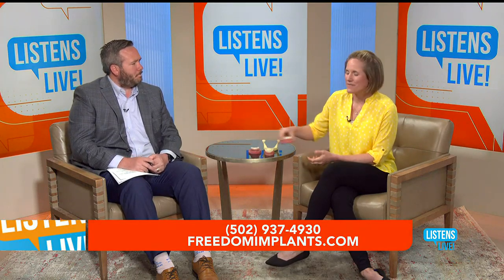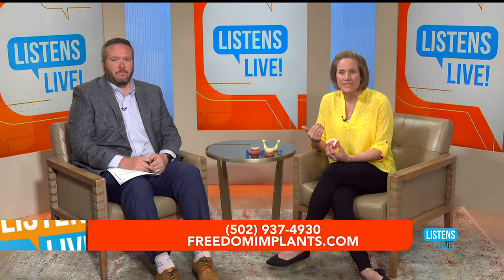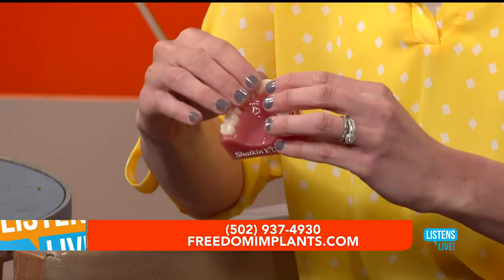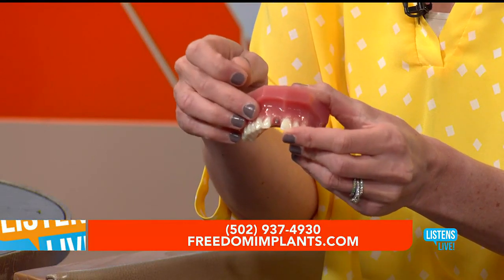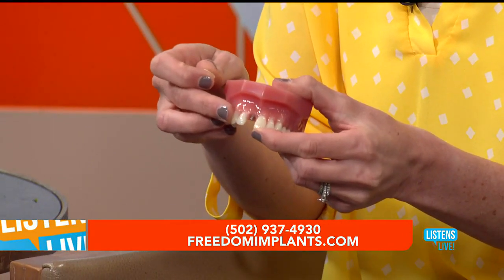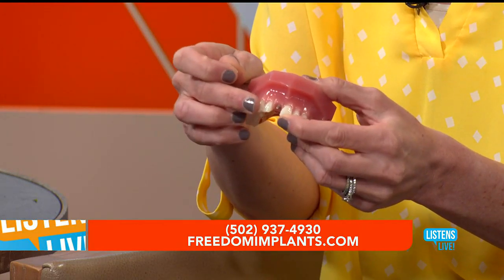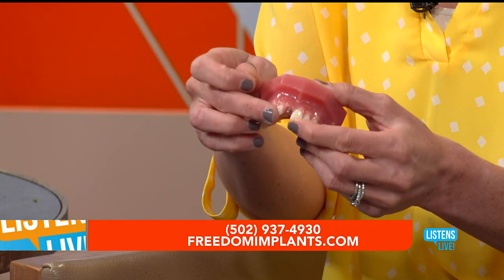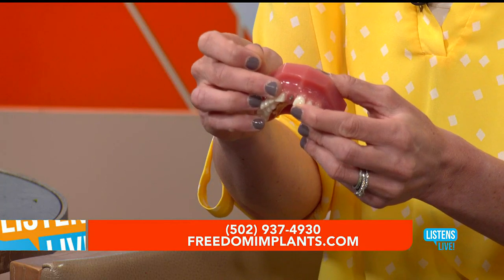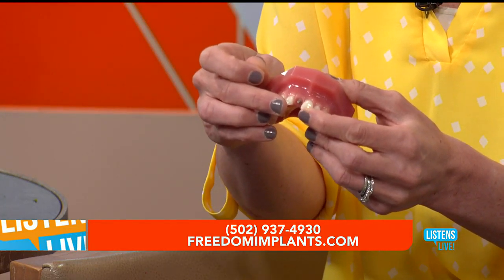Yeah, definitely. Like you said, a lot of people maybe had trauma, a sports injury. Some people are genetically born missing a front tooth or a back tooth. So I can definitely do just a single tooth. This is very similar to what I did this morning. A patient came in, she'd been wearing a flipper for years and hated it. So I was able to place the mini dental implant. Once again, just numbed her up, local anesthetic, no incisions or stitches. Place the implant, and then I was able to put a temporary on there today.